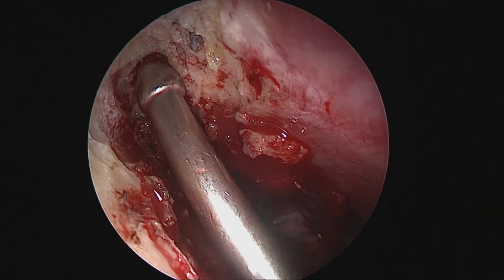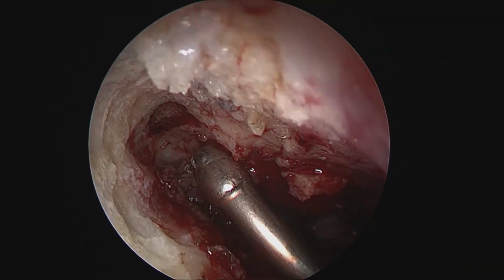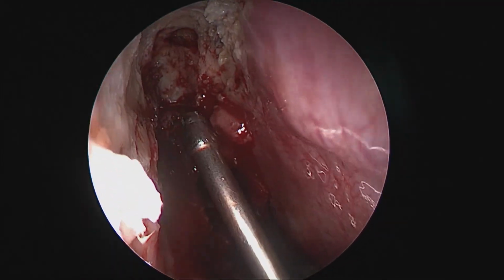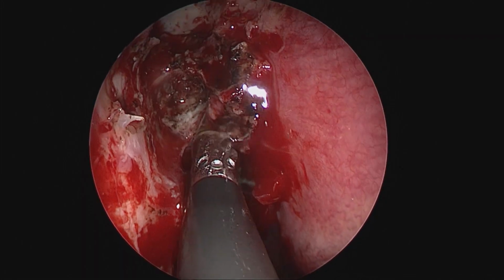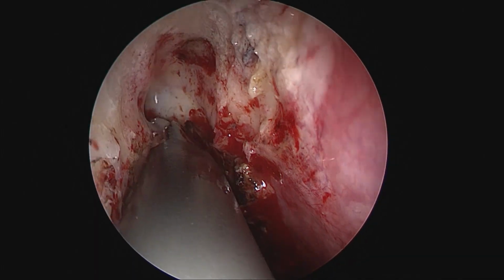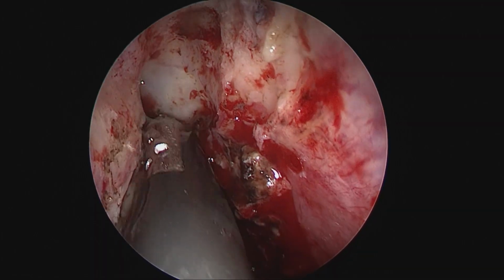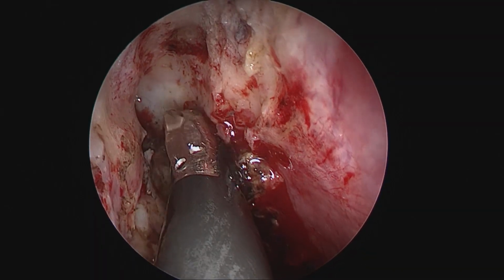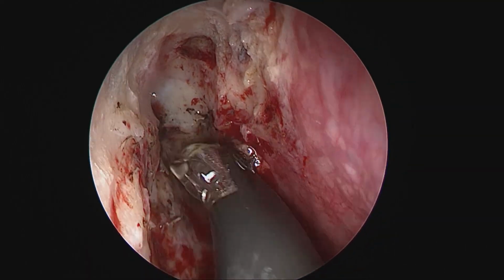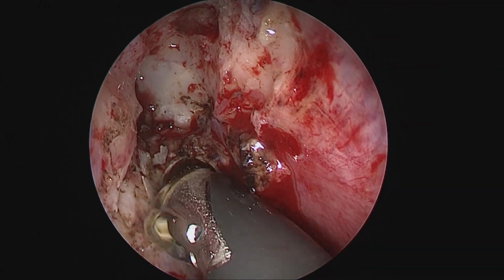So you can see how there's some soft tissue which appears to be the periosteum, or this bone that is still there in the frontal sinus, the frontal recess region, which has to be excised. This also appears to be the region of the supraorbital recess of the ethmoid. Now you see we're using a coblator to completely ablate this tissue, and what you would like in the end would be to have a lot of bare bone here, which we could then progressively attempt to mucosalize or epithelialize with the use of ample amount of irrigation for a prolonged period in the post-operative times.